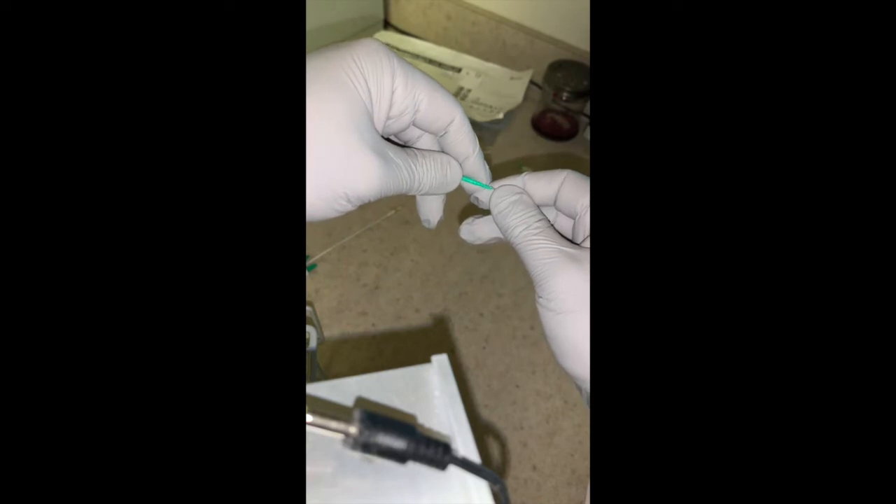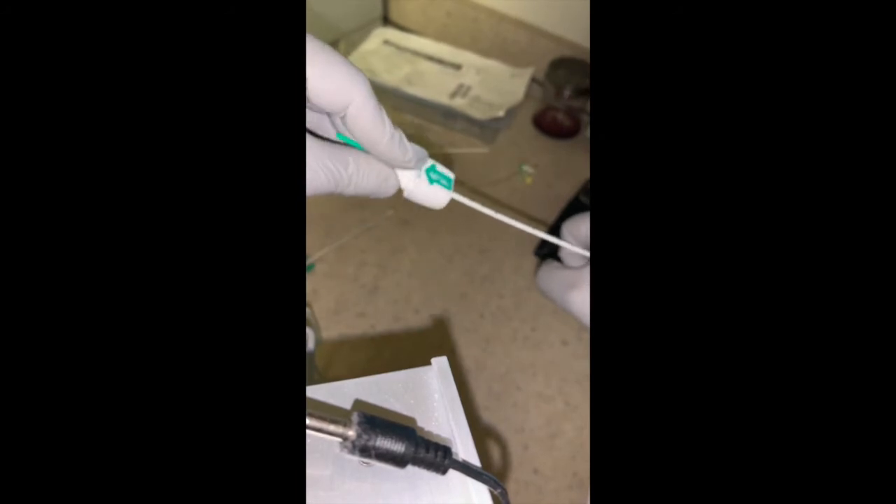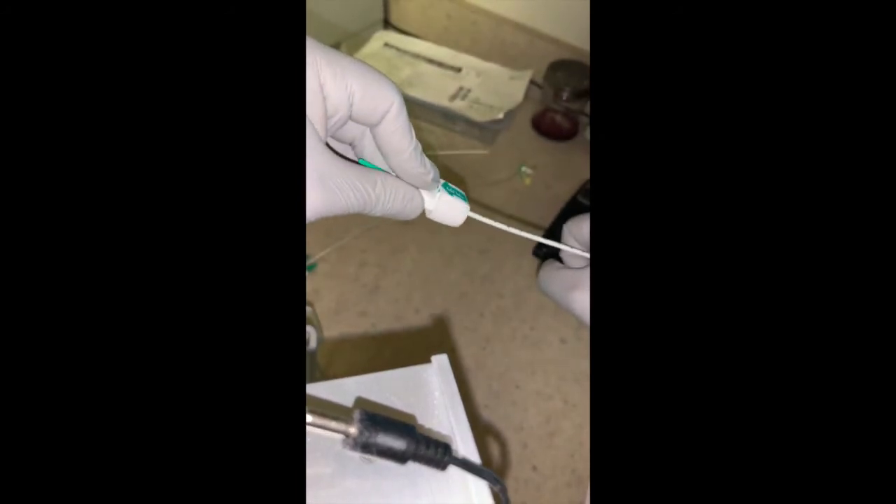With the wire in place, you're going to advance the Angiaseal device into the arteriotomy site, and you keep going, advancing it with a gentle sideways motion.